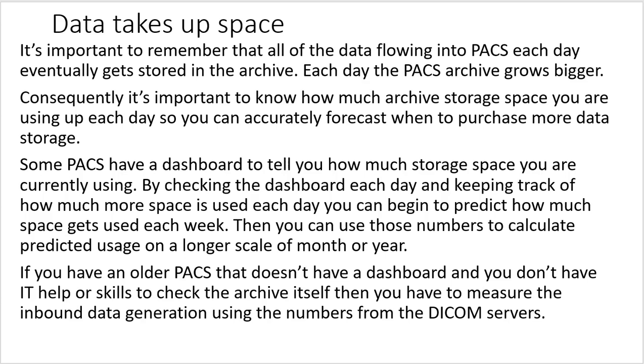If you have an older PACS that doesn't have a dashboard and you don't have IT help or IT skills to check the archive itself, then you have to measure the inbound data generation using the numbers from the DICOM servers, just like the math we just did.